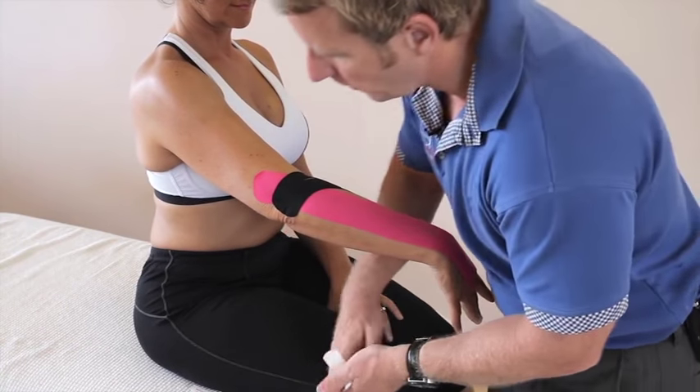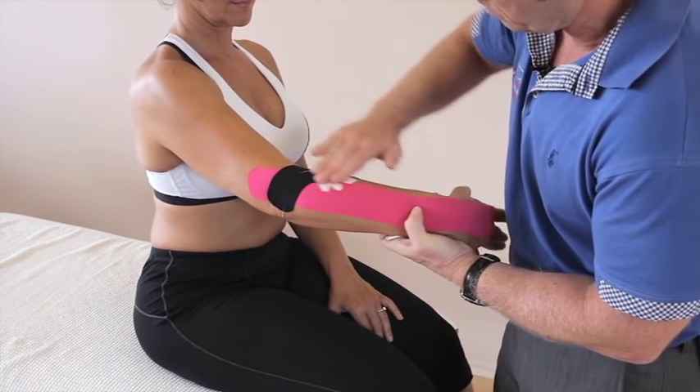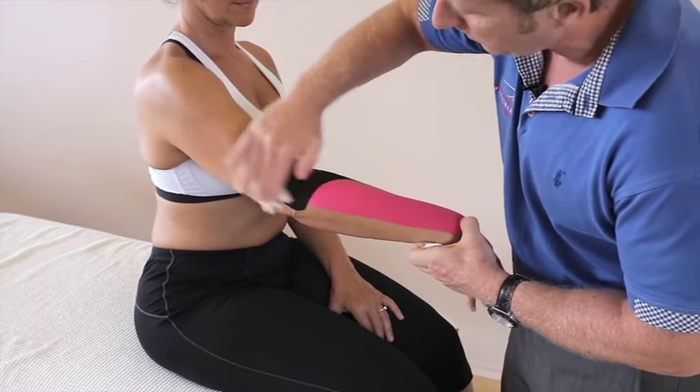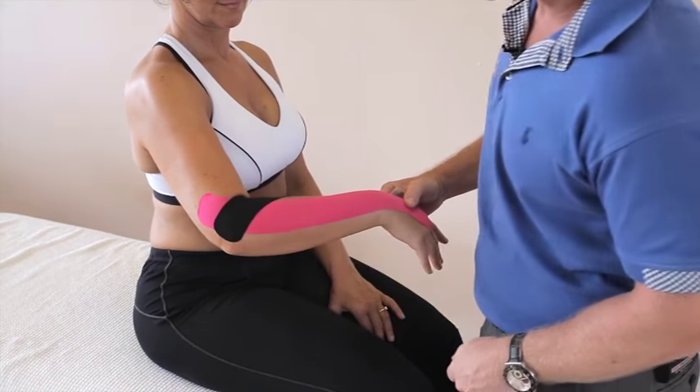You can use the back of the tape just to heat-activate the adhesive. And there we have kinesiology tape applied for lateral epicondylitis, commonly known as tennis elbow.